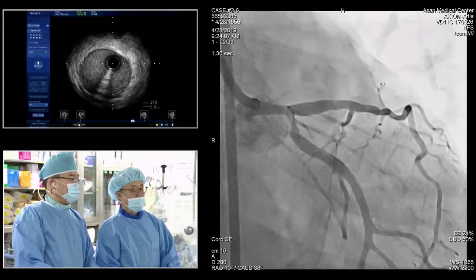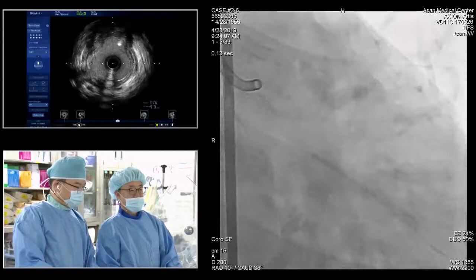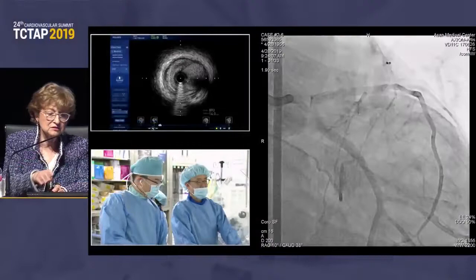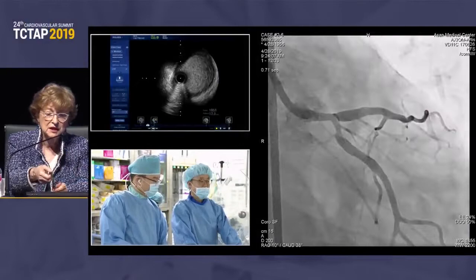So start with one stent, provisional, good, and then into the circumflex. Marie-Claude, do you agree? Yeah, completely agree. As you say, this is a 1-0-1, so I will give a chance to a single stent in the left main, from the ostium. We saw the disease go up to the ostium and going to the circumflex, which is a very big vessel, a very large territory too.